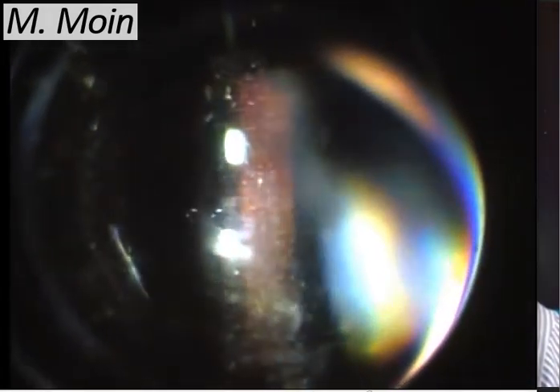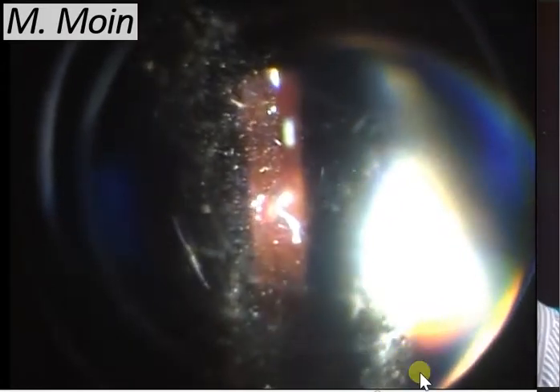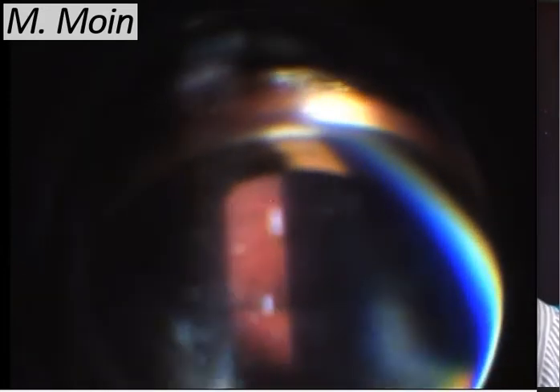The CD ratio seems to be okay in this patient — 0.3. There's a highly reflective shine you get from the surface of the retina with the air bubble. You also tend to see a magnified image when viewing through an air bubble, similar to silicone oil, but the shine is slightly more with an air bubble.